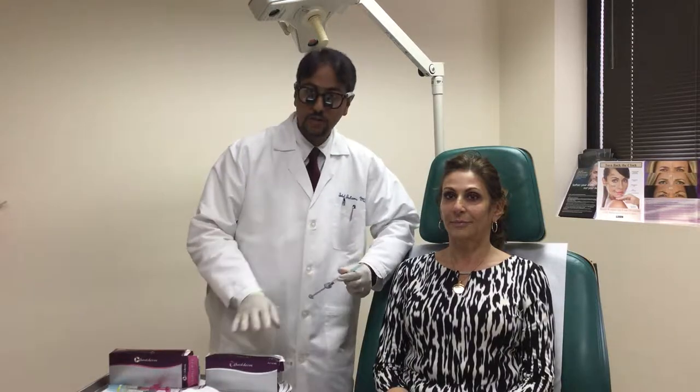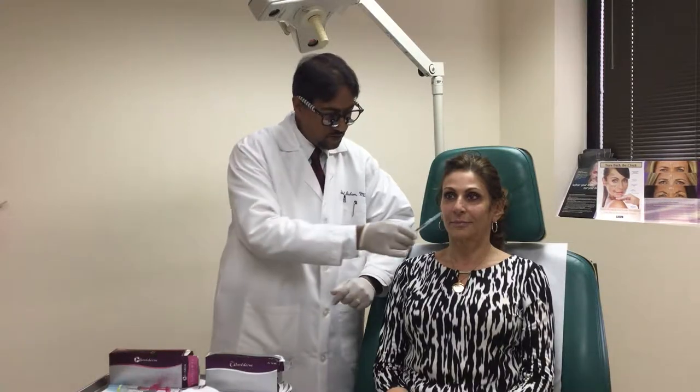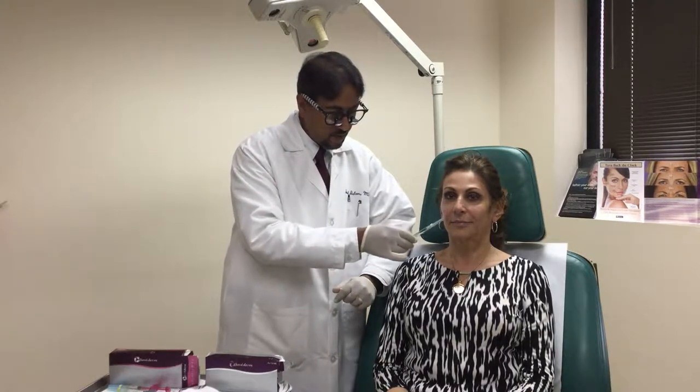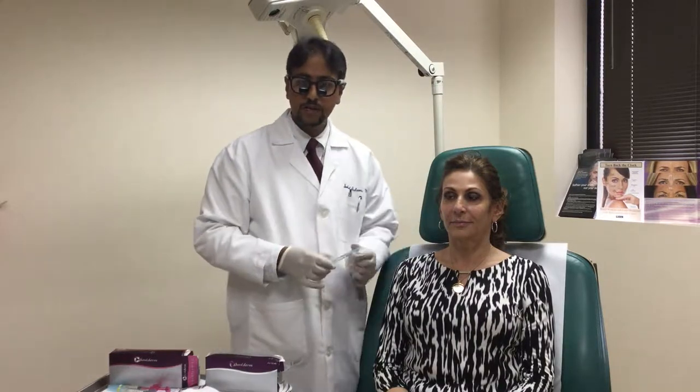Today we're going to be using some Voluma and some Volbella on her face. We're going to do the Voluma along the cheek areas here to give her a little more fullness, and we're going to do the Volbella down here and also in the lip areas.